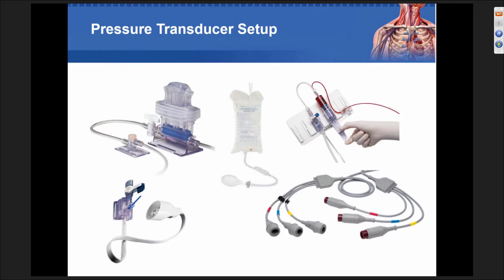Then, after drawing your blood sample, you give the patient the blood back. This is very important if you think about blood conservation and the fact that we don't give a lot of blood anymore. So, whenever possible, we need to give in a closed environment, closed system, one from infection reduction and also from blood wasting. We really need to use those type of devices. So do you use it? And I would like you to ask yourself why you wouldn't if you don't use it.